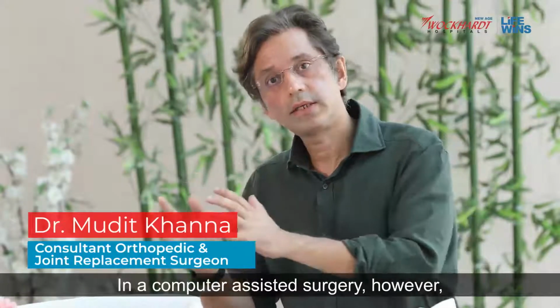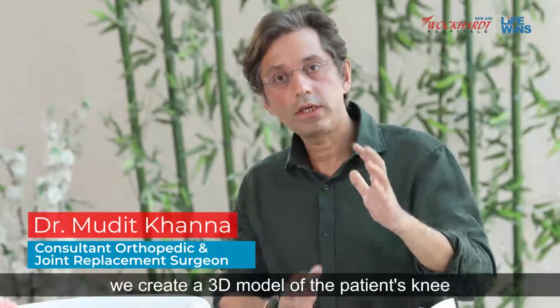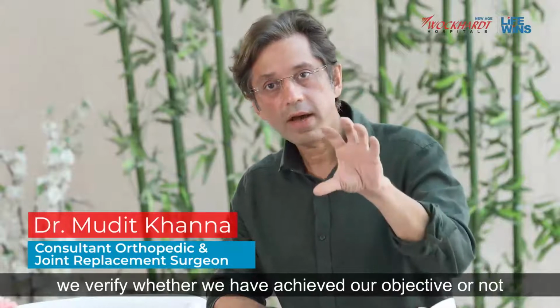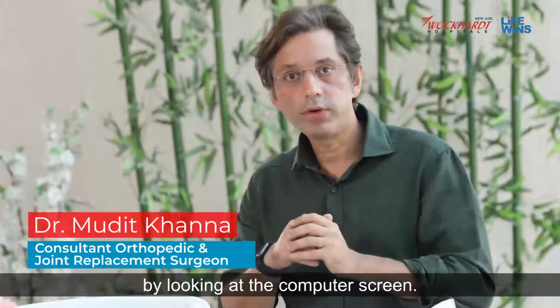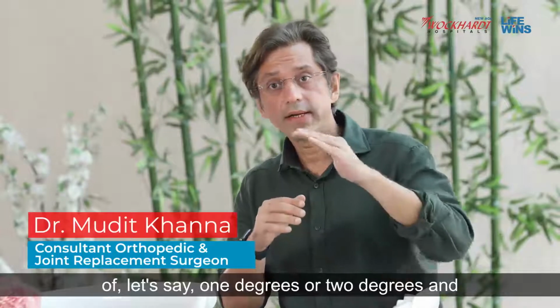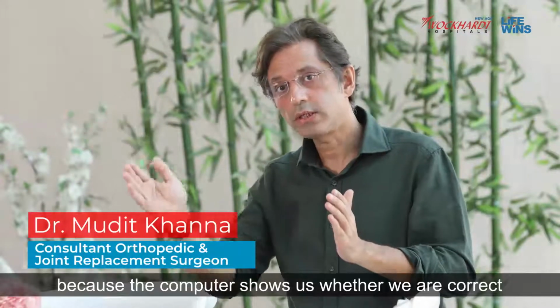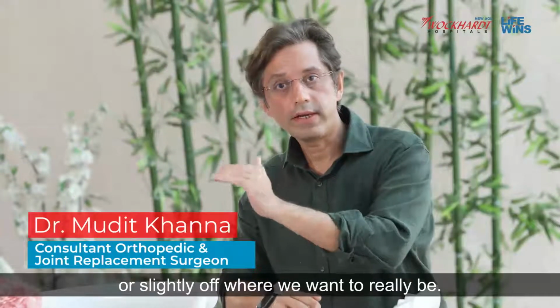In a computer assisted surgery, however, we create a 3D model of the patient's knee on a computer, and as we perform every step of the surgery, we verify whether we have achieved our objective by looking at the computer screen. Even if we have a minor error of, let's say, 1 or 2 degrees in correcting the alignment, we are able to spot it because the computer shows us whether we are correct or slightly off from where we want to be.